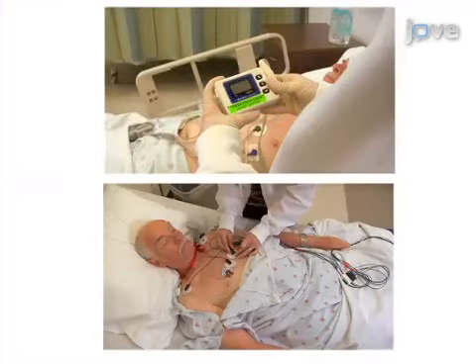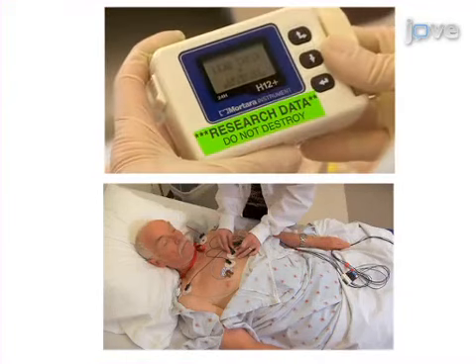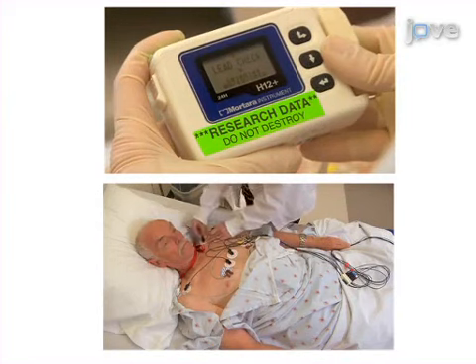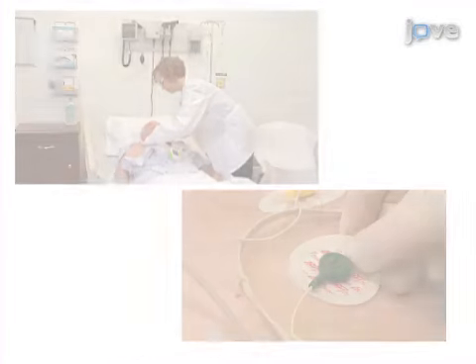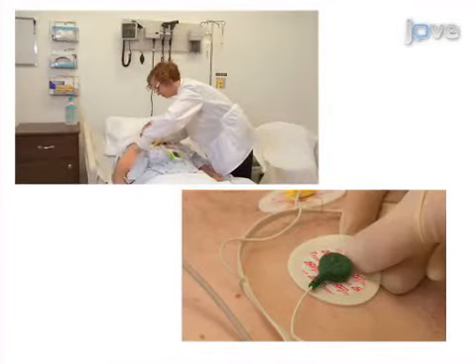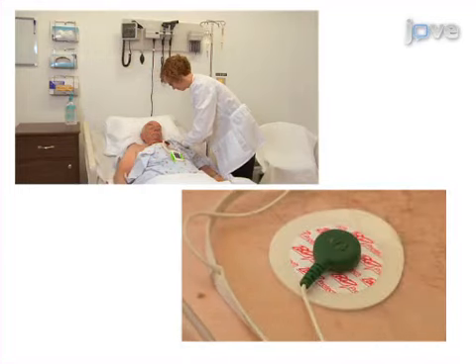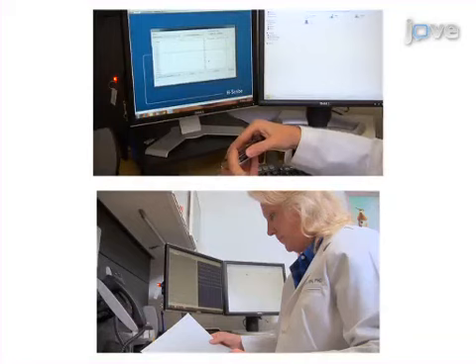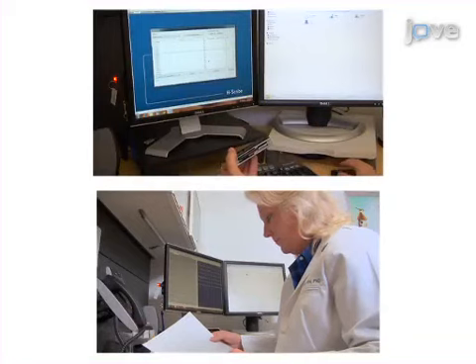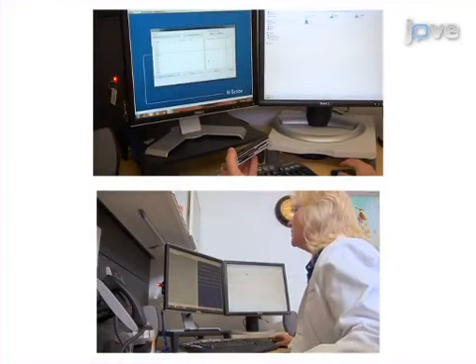A 12-lead ECG Holter monitor and a routine bedside ECG monitoring system are applied. Monitoring is maintained throughout a patient's entire hospitalization. The systems are regularly checked to ensure that the skin electrodes and lead wires have not been moved or misplaced. Finally, the stored ECG data is downloaded from the Holter's flashcard to a computer for offline analysis.